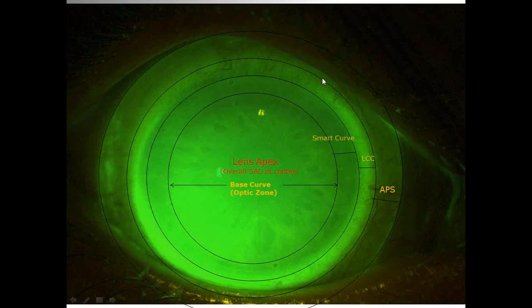At the end of the day, I'm not fully convinced that we have to completely clear the limbus at all times. I think that a lens which at initial fitting shows good limbal clearance, but with settling in time shows that it can actually gently touch the limbus, is okay. We just don't want to create pressure on the limbus. So I would look for staining at follow-up, as you had mentioned already too, John. If we take off the lens and see staining around the limbus, then that's a concern, of course. But thinning of the fluorescein in a couple of clock hours, especially if you can pull the lids up and get that fluorescein to extend into that area, or if the patient looks free of staining and has good comfort with the contact lens, I think we can monitor that and live with it.